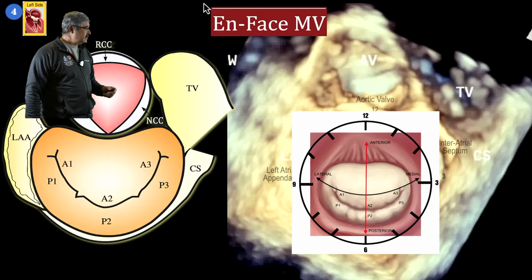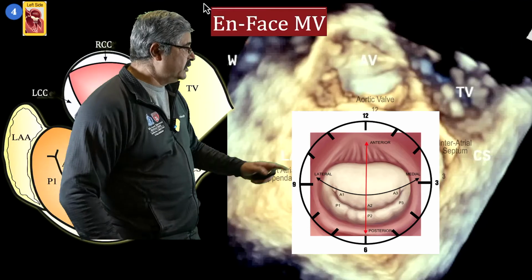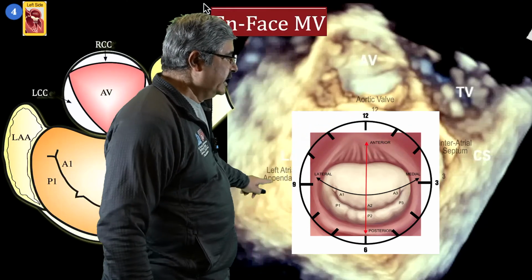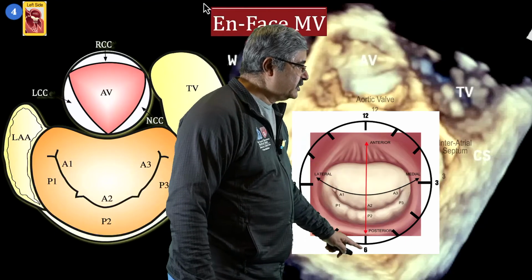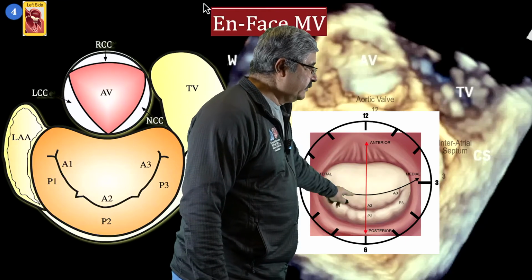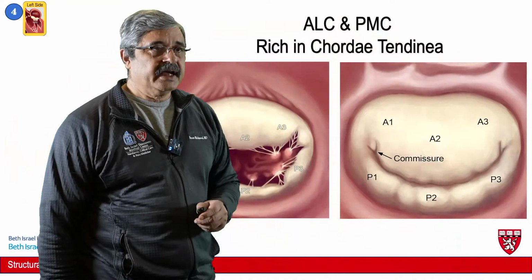So this is how it is. The aortic valve is at 12 o'clock position. You can see right here. The atrial appendage is at 9 o'clock. This is the posteromedial commissure. This is posterior. This is anterior. And remember, we said this is the center portion of the valve, the more important, where the majority of the action happens.